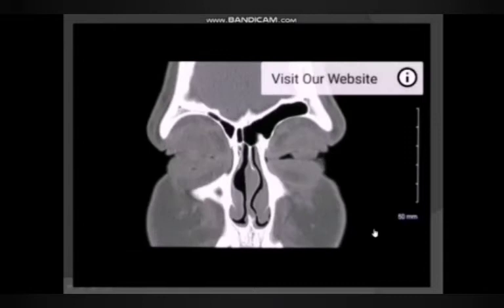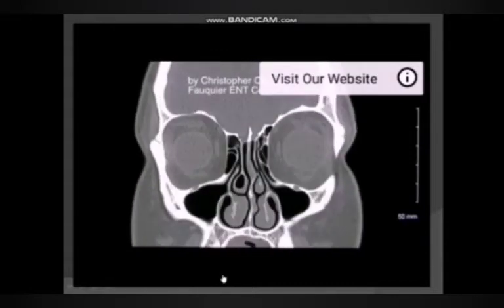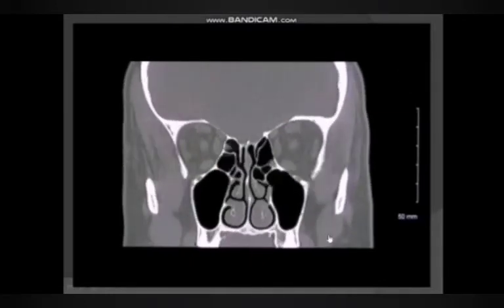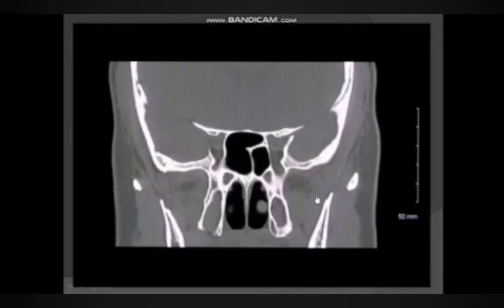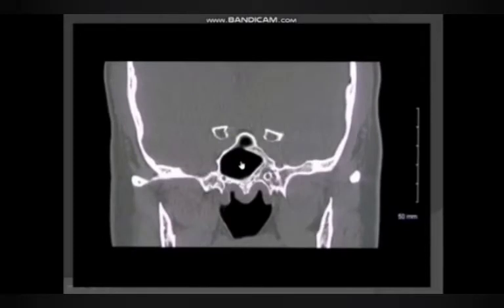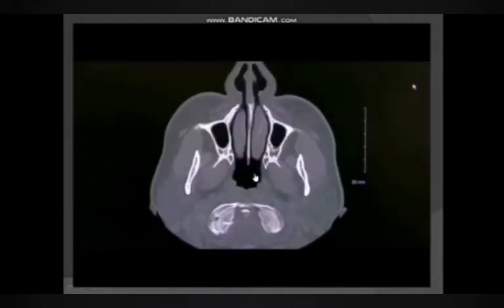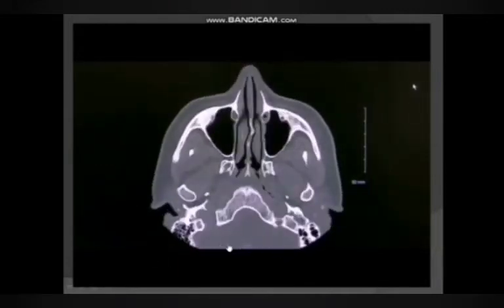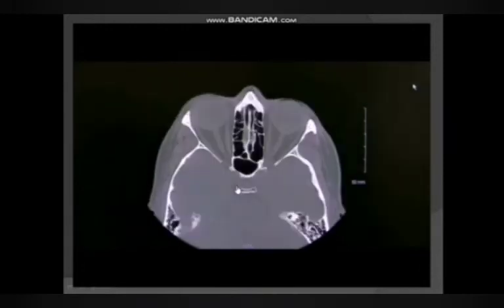Here we have a video of a CT image in coronal view, showing how it has an excellent differentiation between different types of tissue. In CT, there are basically 3 colors: white, black, and gray. Black is for air, while white is for bone, and the gray is indicated for fluids and soft tissue like brain and eyes. The view here is axial plane moving in upward direction.